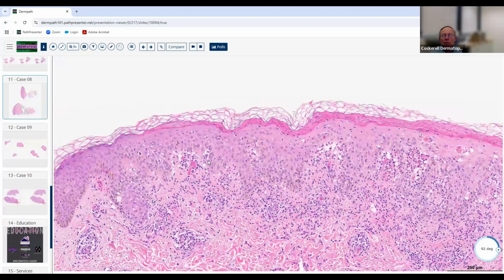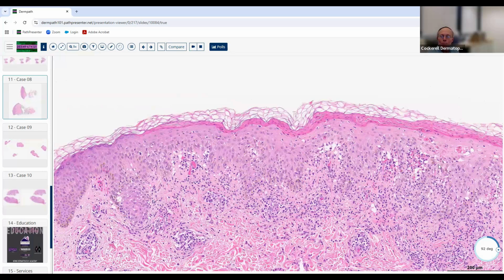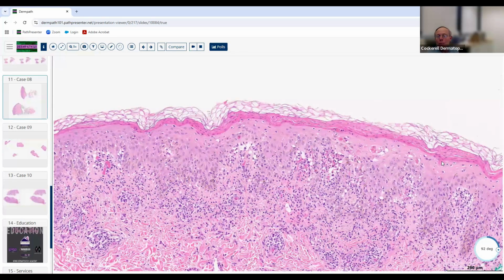Now, this is an interesting lesion because if I were going to ask you how long you think this lesion had been present, I would hope you would say maybe only a day or two. It's probably a fairly acute lesion because it wasn't really scaly yet. And why was it not scaly clinically? Because it's still got the basket weave cornified layer on it. This is going away. If we biopsy this in a couple of days, this is gone, and it's just dealing only with this at the top. So this is being sloughed off.